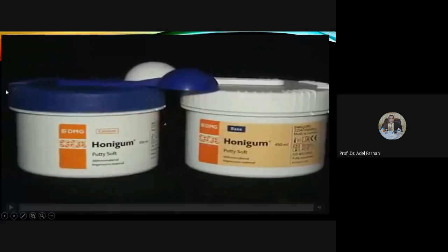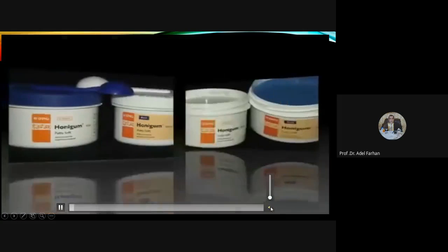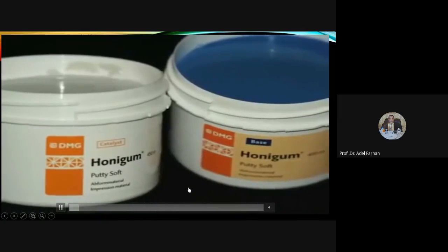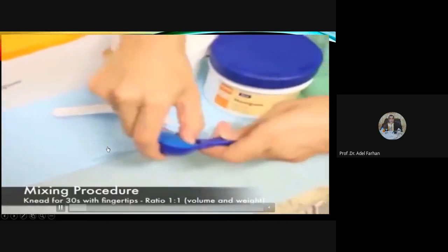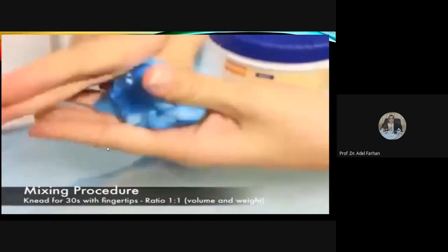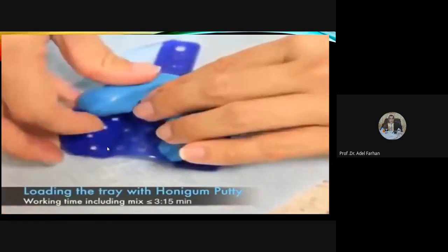هنا راح تشوفون كيف we create space بطريقه تكنيك اخرى. ايضا نفس الشيء عندنا الهيفي باتي واللايت بادي. اوكي هيفي باتي سوري، واللايت ايضا you mix it. طبعا هنا ما راح نستعمل البوليثينيل سبيسر.